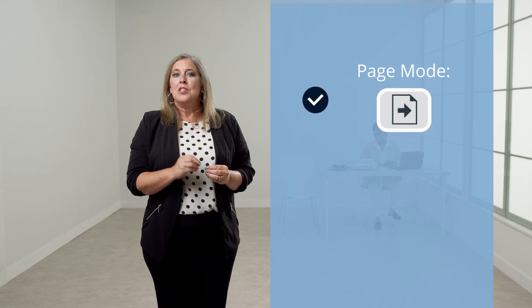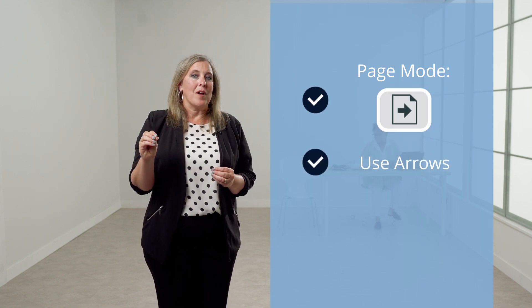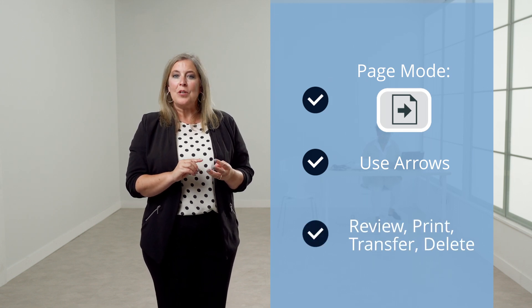Up to 12 completed tests are automatically stored in the memory of the GSI 39. You can access and manage saved tests by entering page mode. To do this, press the page mode button. To scroll through the saved tests, use the arrows on the front panel. From page mode, you can review, print, transfer, or delete stored tests. To exit page mode, press the page mode button again.